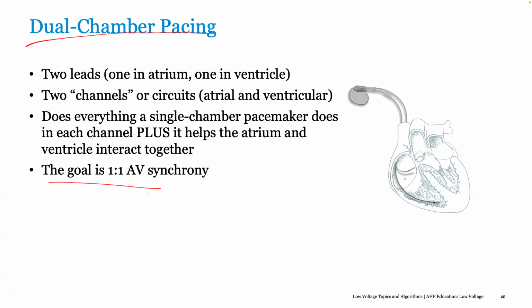And as AJ said, maybe keep your higher end devices on the shelf for those patients who present with intermittent heart blocks or 2-to-1 blocks who don't need pacing all the time. Then you can use those AAI, DDD modes.